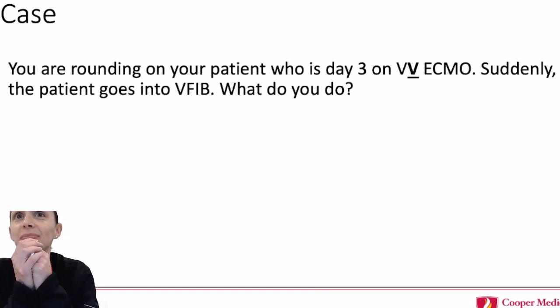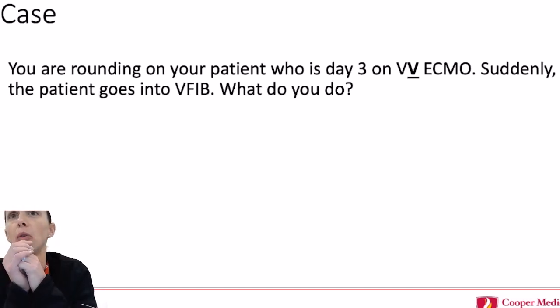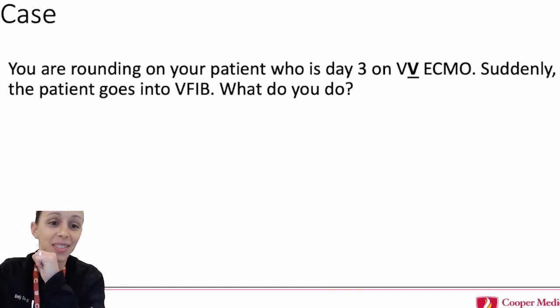That leads me to my second question. Would clamping be faster, or would you turn down flow first? You could do that too. It would move slower, but both. This is an all hands on deck sort of scenario. Clamps always work the best. And that's the same thing that Emily touched on. These are your best clamps. Whenever in doubt, clamp off and scream for help, and somebody will come running.